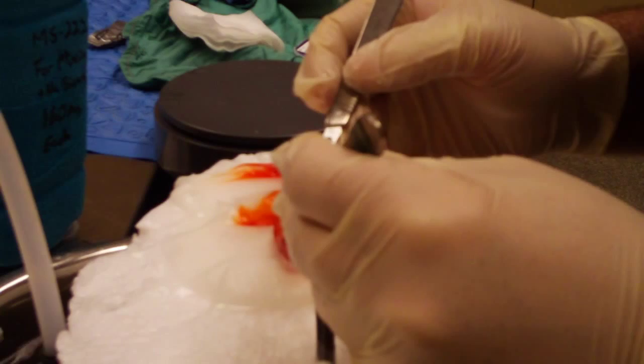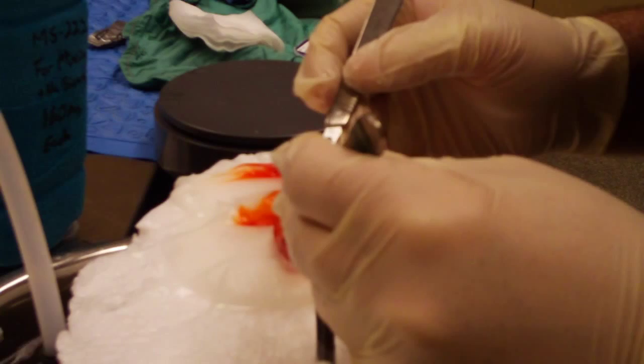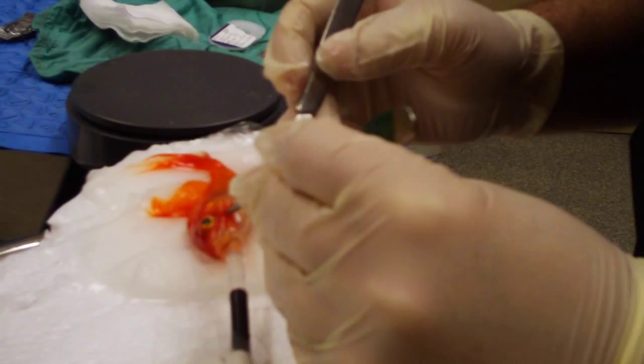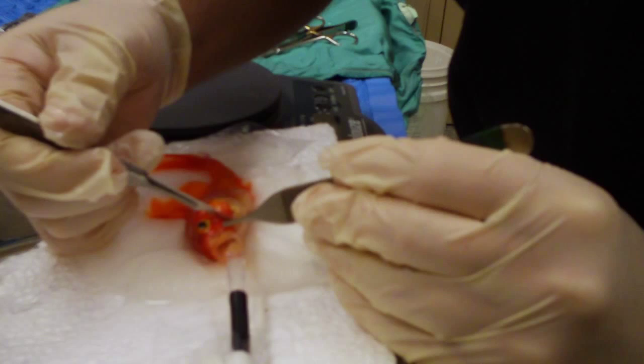Now that Shakespeare is at a proper depth of anesthesia, we can begin our surgery. He's sleepy enough that he shouldn't feel any discomfort, and we're only going through the top layer of skin to remove this tumor. It's over the gill plate and very close to the eye, so we're not able to have very wide margins to remove it.